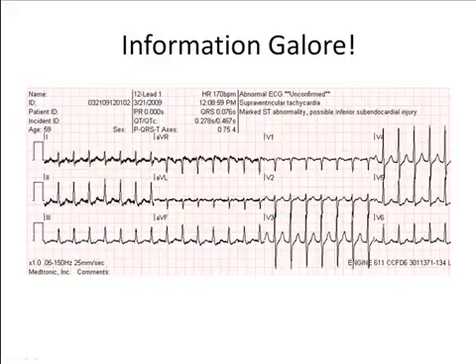As we know, only interpretations that are viewed in the diagnostic mode are reliable. Therefore, look to verify that the monitor is in diagnostic mode by looking at the Hertz range. ST changes are captured in the lower frequencies, below 1 Hertz. Acceptable ranges are 0.05 to 150 Hertz or 0.05 to 40 Hertz. Here, the LifePak 12 range on this monitor is set at 0.05 to 150 Hz.